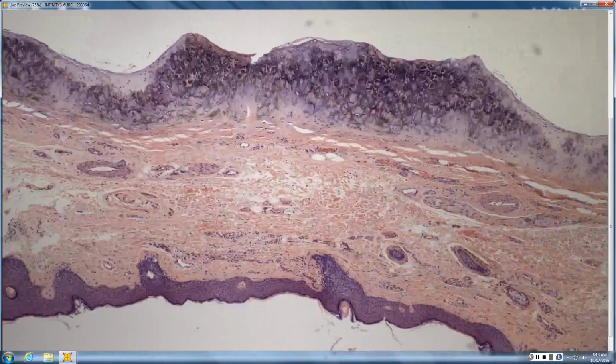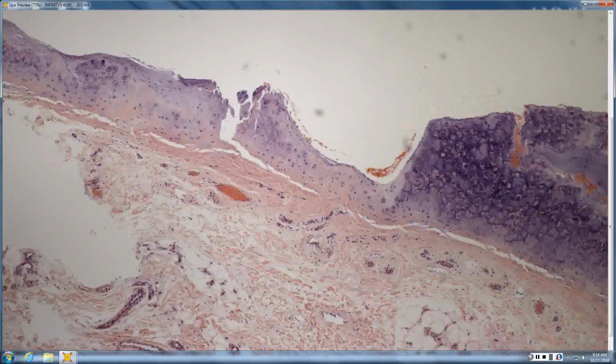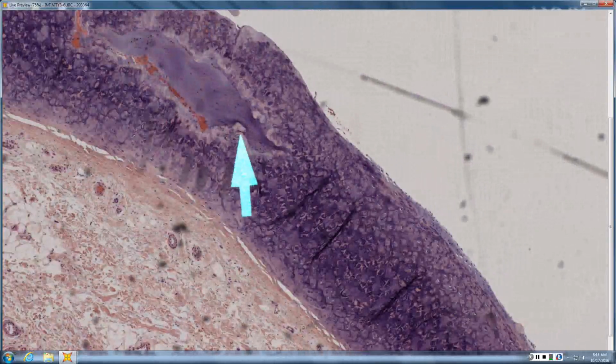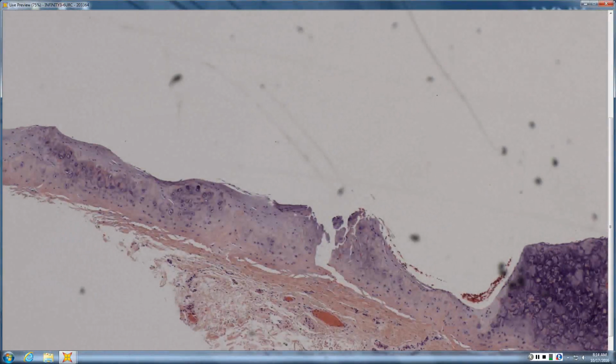Cartilage. Maybe pseudocyst of the auricle? That is exactly what it is, the pseudocyst of the auricle. Well done. So you have cartilage, and then the cartilage degenerates, and you have myxoid material in the middle, and then you only have half of your cartilage because the other half has fallen away. So you have a pseudocyst of the auricle or boxer's ear. Your sister slaps you up the side of the head, and you get a degeneration of the cartilage. Same as cauliflower ear in wrestlers. Same thing. Cauliflower ear, boxer's ear, nasty sister ear.